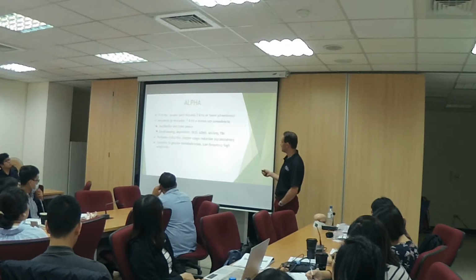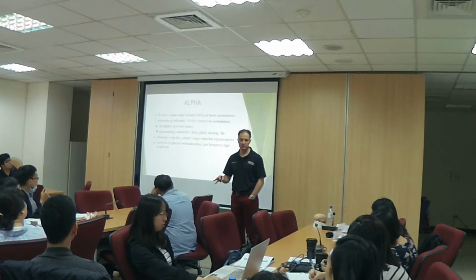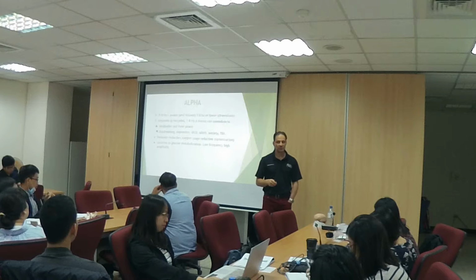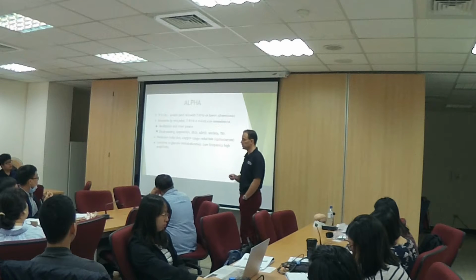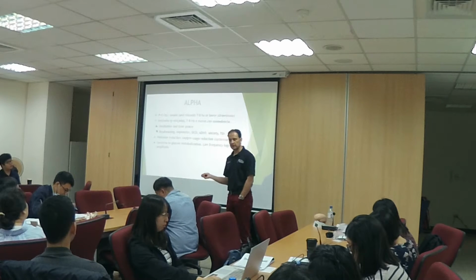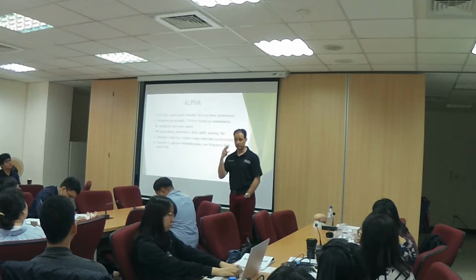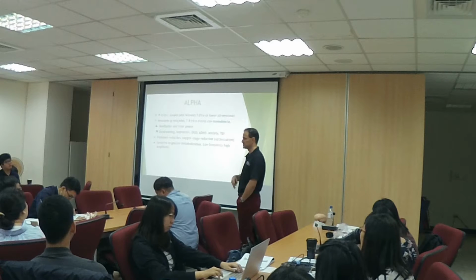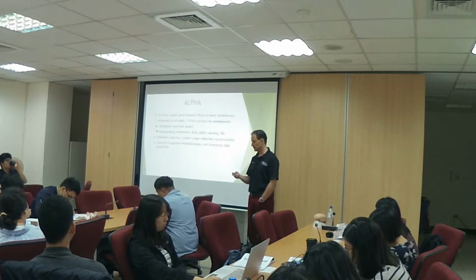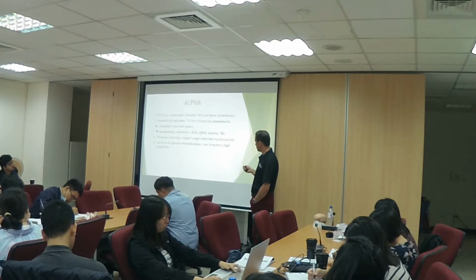Now, I didn't put that here, but slow alpha below 10 hertz, it could mean that the person is using drugs, especially marijuana. So some marijuana users, you can confront them. You look at the EEG, and you suspect that they're smoking it, and you go, I see all that marijuana you're smoking, it's making you feel stupid. And they open their eyes and go, how do you know I'm smoking marijuana? And please don't tell my parents and this and that. So you can gauge it. You can suspect it, but it's a good indication. So again, it's hypoperfusion if it is lower than 10 hertz.